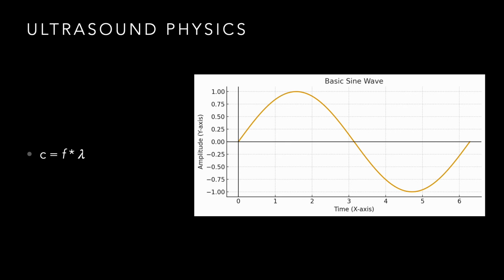I'm going to blast this out at X many hertz, or X many megahertz. So you get to a piano, you hit one of the keys, and it's going to be a frequency that's transmitted at a certain number of hertz. And we hear that.